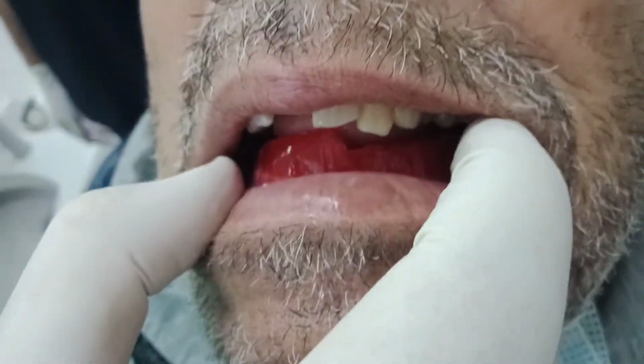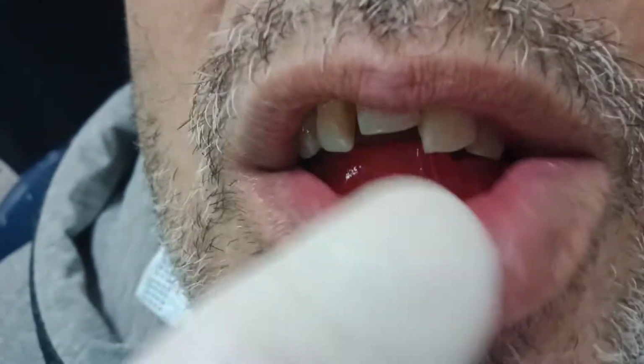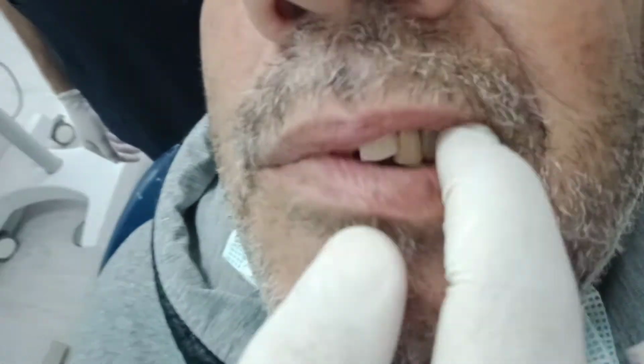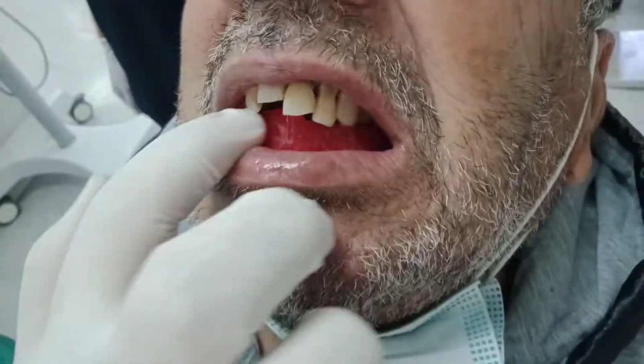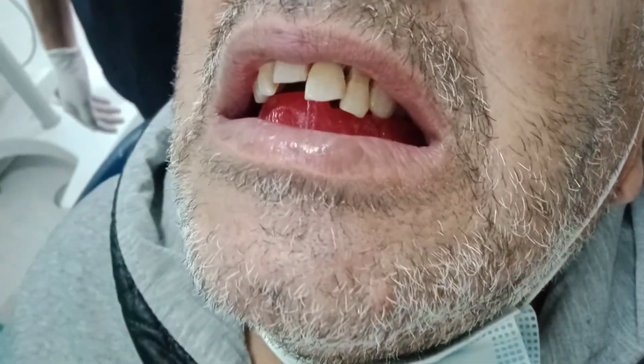1, 2. Okay, the freeway space is sufficient posteriorly. 4, 5, 6, 7, 8, 9, 10. You don't see it in the camera, but I've seen it in the posterior region and the anterior region. I have sufficient freeway space, so we have determined the vertical dimension correctly.